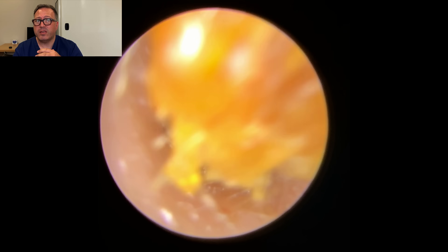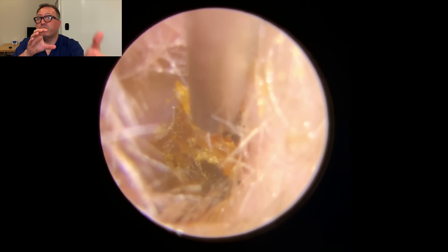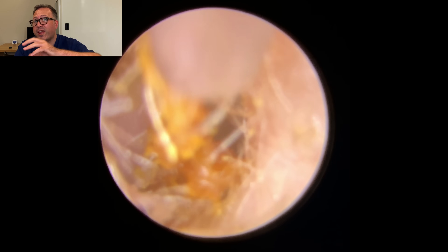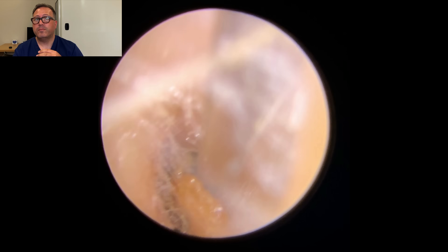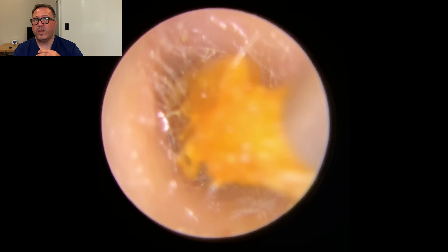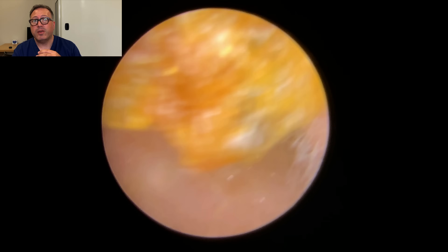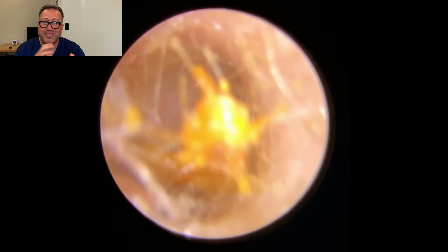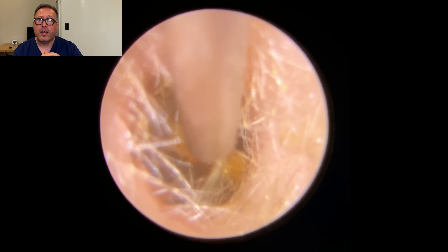You can see we're slowly working the next section down the canal — it's brought the next piece forward. We're really starting to unravel this now. It's got a good grip. Wiggle up and down to help feed it out of this ear canal. There we are — that's brought the next section. You can see how much is in there — it's like Aladdin's cave, there was so much in there to come out.